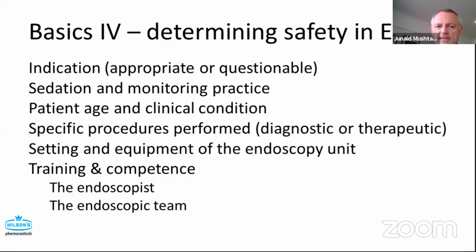So another aspect to getting the basics right is determining safety in ERCP. And again, this is something that we will come back to. So indications, which we will talk about, sedation we've covered, age, specific procedures performed. So we have to think about, is this a straightforward ERCP? Is it complex? Is it advanced?